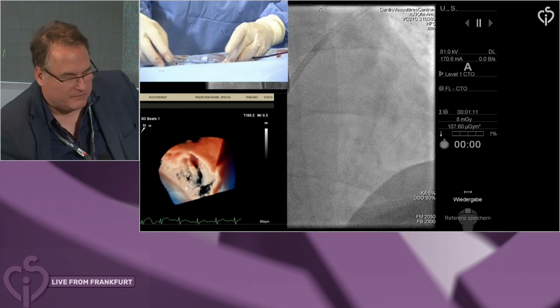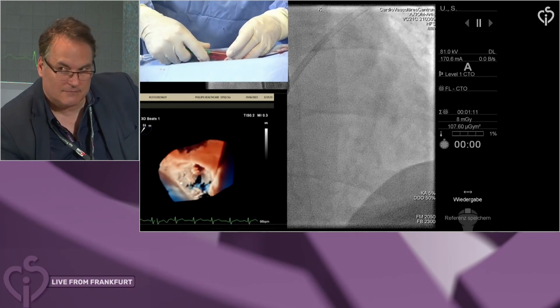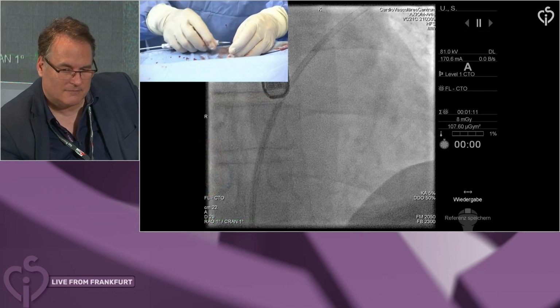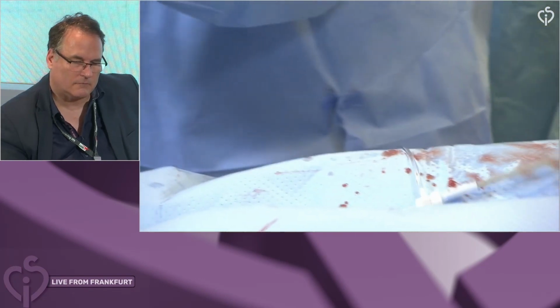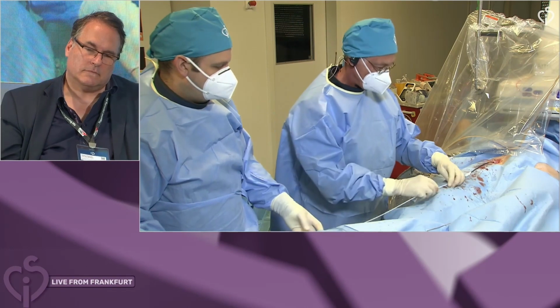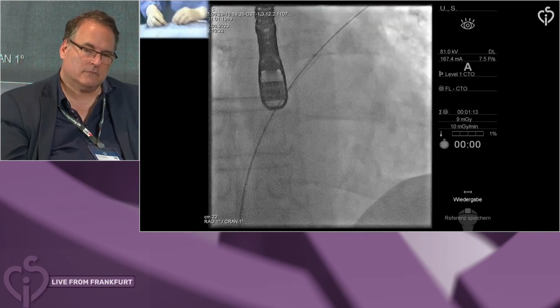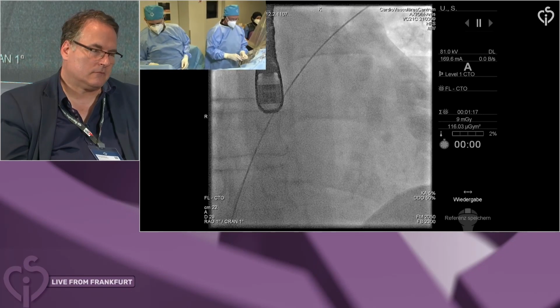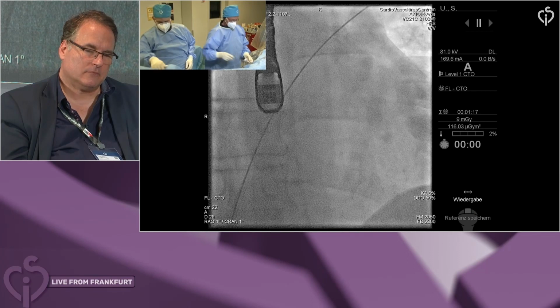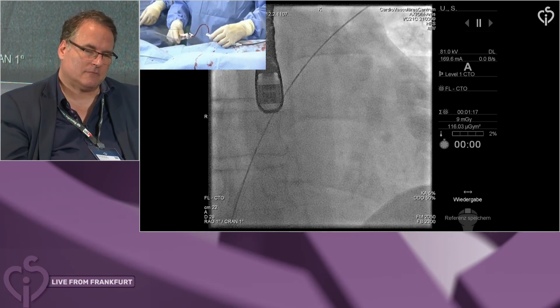But also, look at what I'm doing now. I want to do an angiogram of the PFO. In order to do that, I insert the sheath into the left atrium, for example, into the pulmonary vein. I have removed the dilator. I'm now inserting the wire again. So the wire goes into the pulmonary vein right there. And now I pull back the sheath to the level of the PFO. I have to do a high volume injection with high speed. So we usually do 30 cc per second and 20 cc of contrast. De-airing is, of course, important.